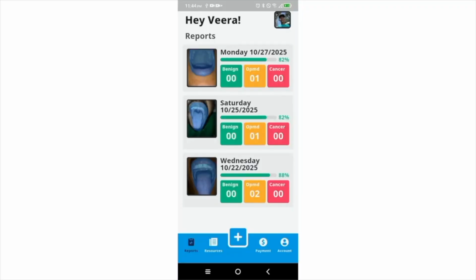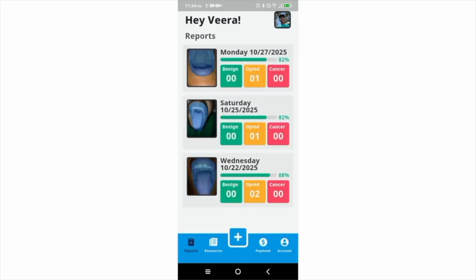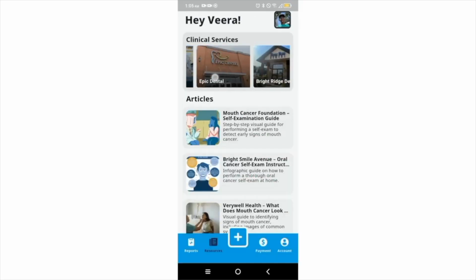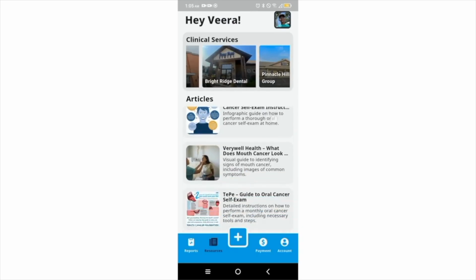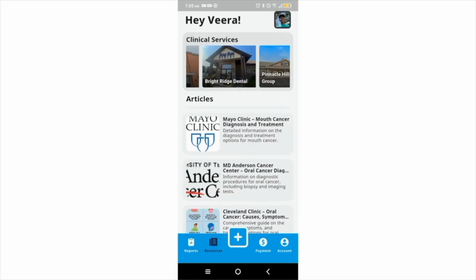This is the OralScan app. After signing in with Google, users first see their previous diagnoses. By selecting a specific diagnosis, they can access more detailed information. On this page, users can find nearby screening locations and get directions with a single click. Additionally, they have access to a curated catalog of reliable resources for oral health information.